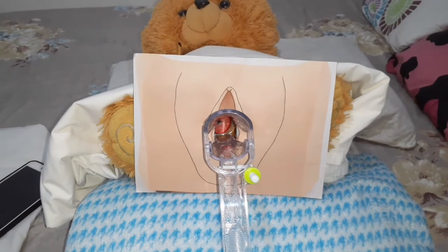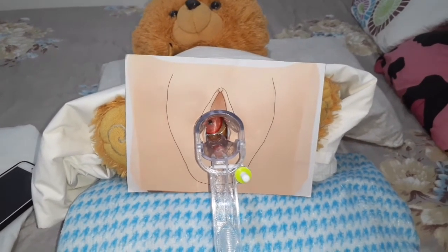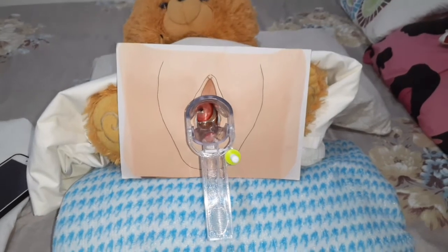So that is how we get the 3 specimens: endocervical, cervical OS, and vaginal pool specimen.